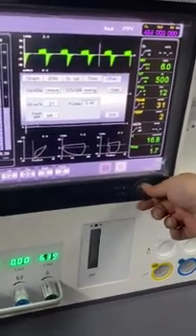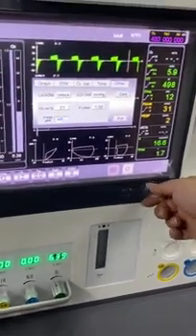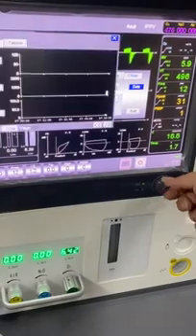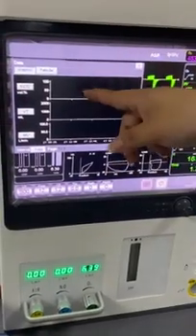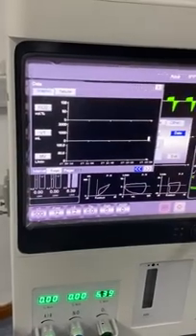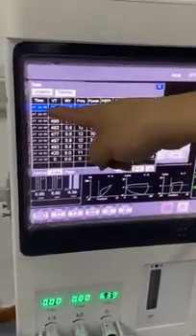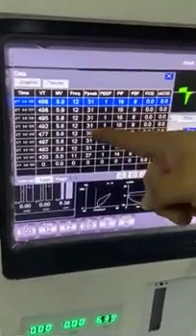And here is for the flow setting, and you can also adjust it. And also for the fresh gas, you can change it. And then here we have the data, and under the data you can see another column come out. This one is specially made for the doctors to see each of the parameters and the waveforms synchronized here. And also with the time and the change, the doctors can know everything very clearly, the difference every second.